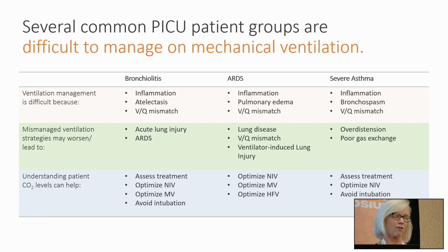As y'all mentioned, I've been practicing respiratory care for 30 years. When I first started 30 years ago, when someone needed an oxygen saturation, they'd call the RT. We'd go up there with our pulse ox, we'd read their pulse oximeter, we would chart it, we'd go on about the day. Now, we don't do that. The patient care techs do that. Everybody does that. You go on Amazon and you give Jeff Bezos some money and he's going to send you a pulse oximeter, right? So we all are very aware of oxygen status and how important it is.